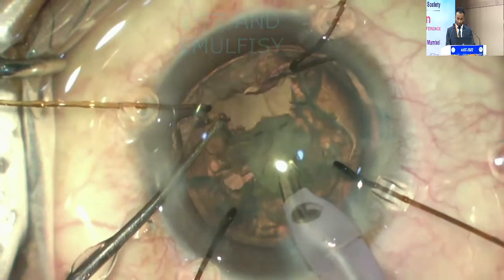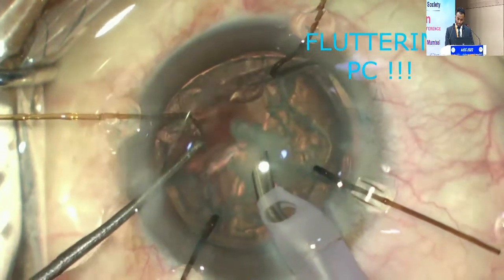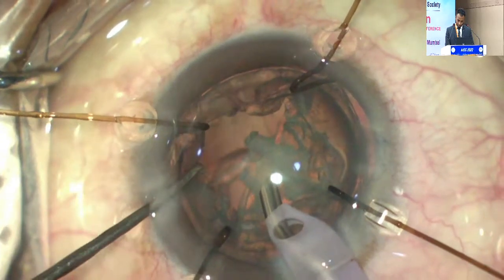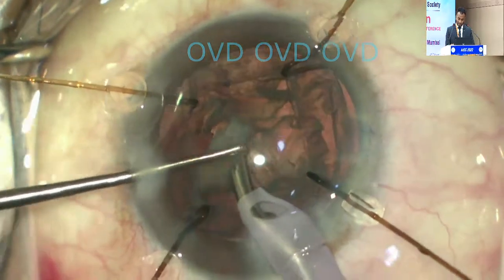If you can see in the quadrant, you may see some fluttering of the PC, and you have to be very careful about it. Otherwise, the whole bag may just come out. Replenish with OVDs so that the PC is pushed back.